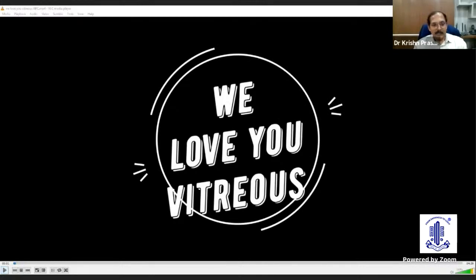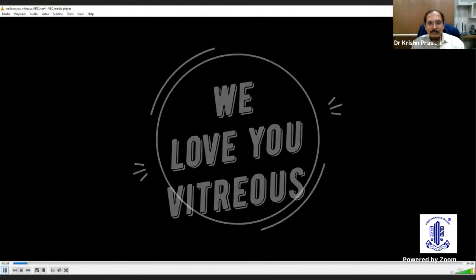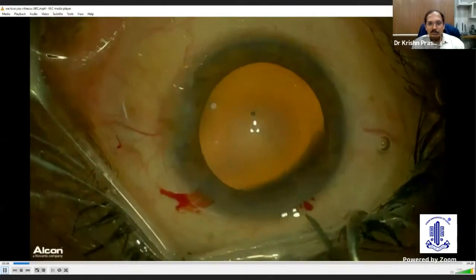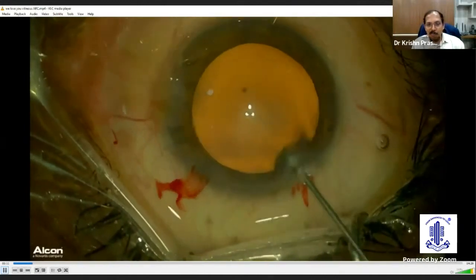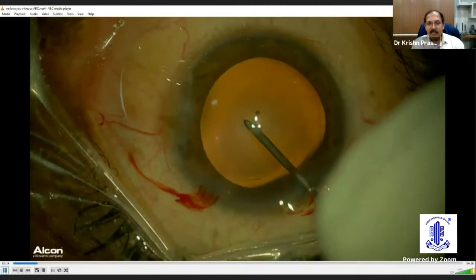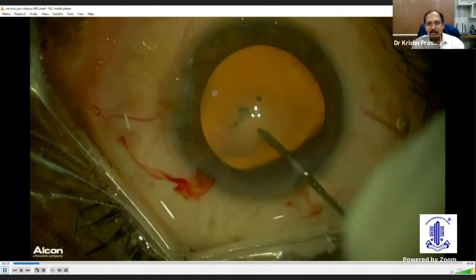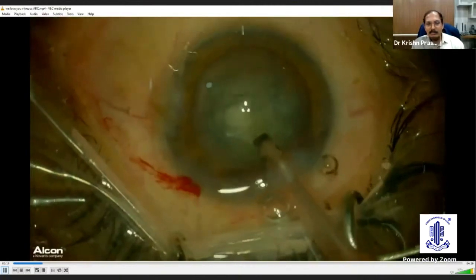We always despise vitreous. We hate vitreous coming without invitation in our cataract surgery region. But this is a situation where we start loving it. This is a routine case where the surgeon is starting his cataract surgery and has started his rhexis.